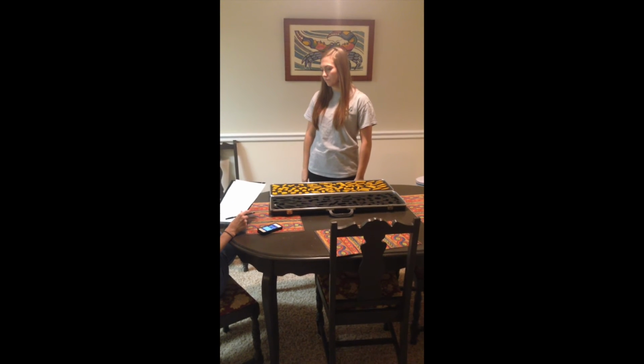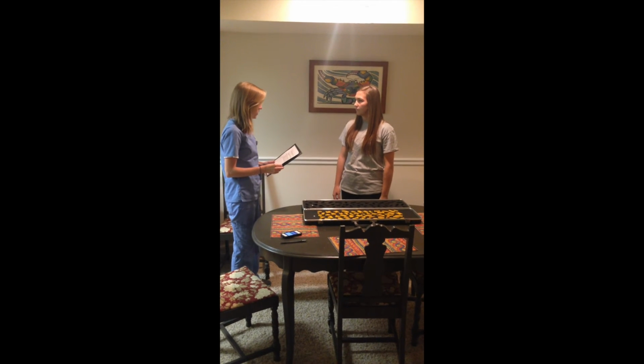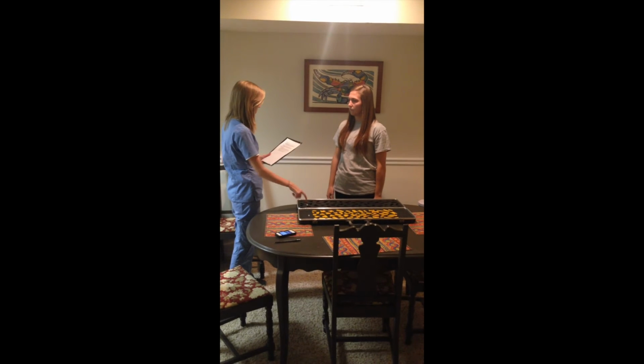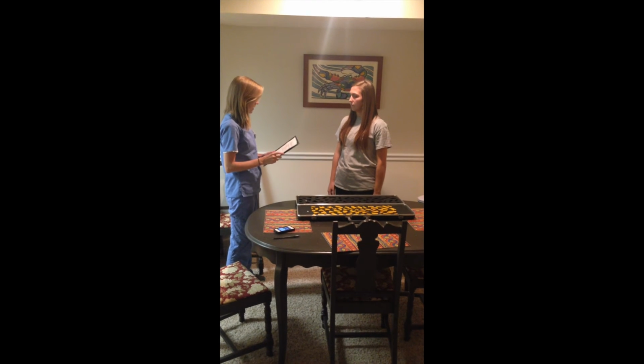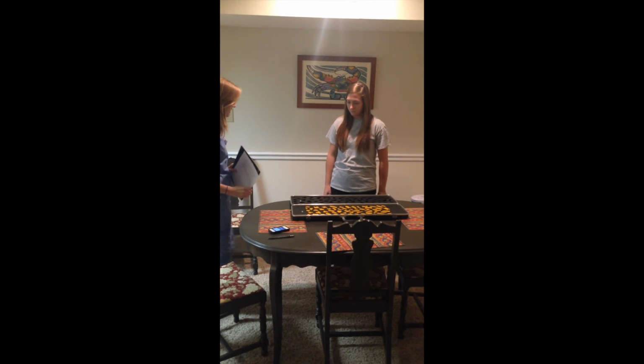Rest for a few minutes while I get the other boards ready. Now, just as you did before, work as fast as you can to put the blocks in their proper places onto this board. Use only one hand and keep the yellow side of the blocks up. Ready? Go.